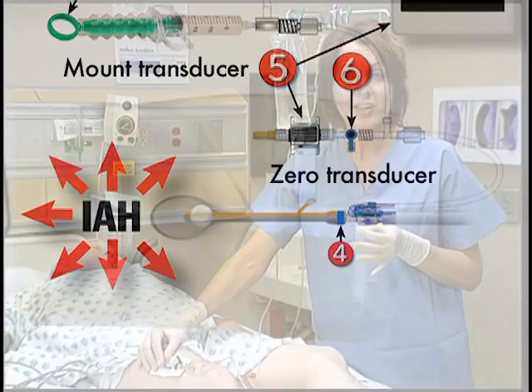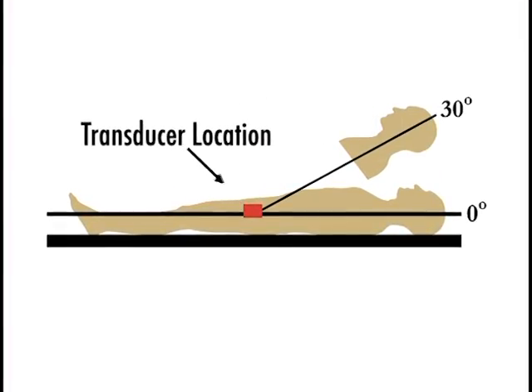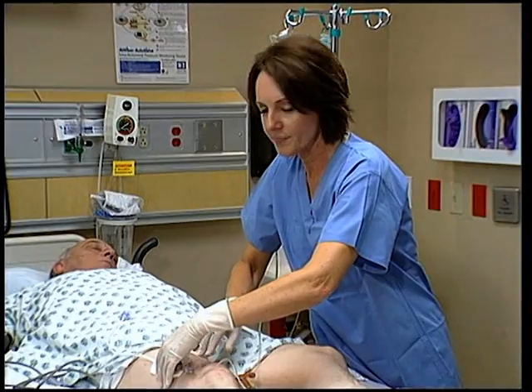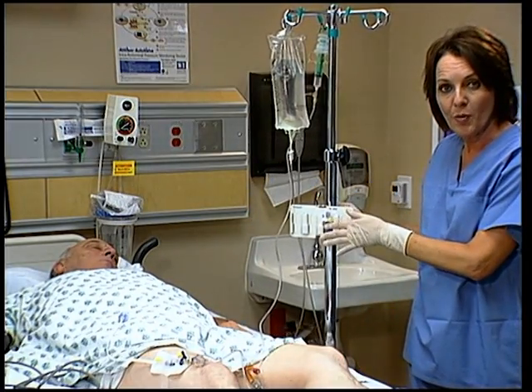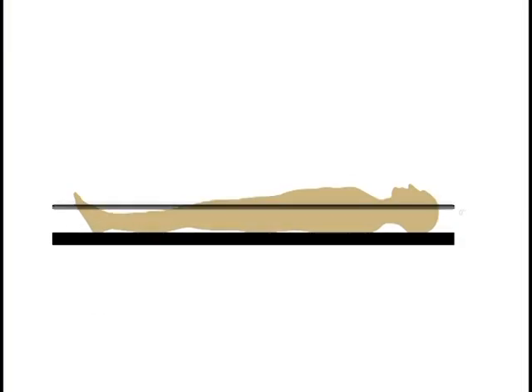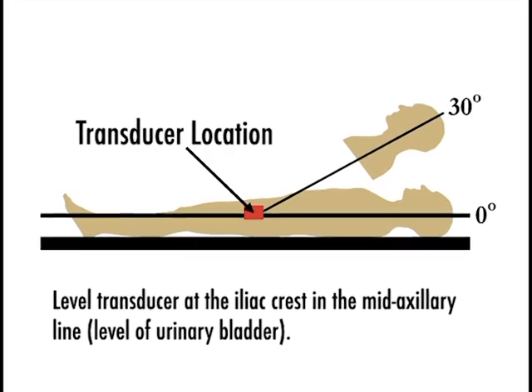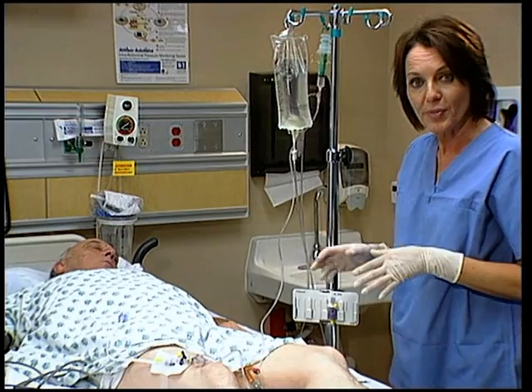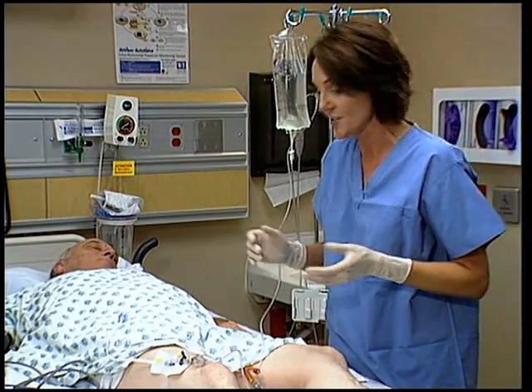Now mount the pressure transducer to the patient or the pole. For patient mounting, place a 4x4 on the thigh at the level of the iliac crest in the mid-axillary line and tape the transducer in place. If you choose to pole-mount the transducer, place it in your pole mount bracket and adjust the bracket to the level of the iliac crest in the mid-axillary line. Once mounted, plug it into your cable and monitor and zero it just as you would normally zero an arterial line transducer.